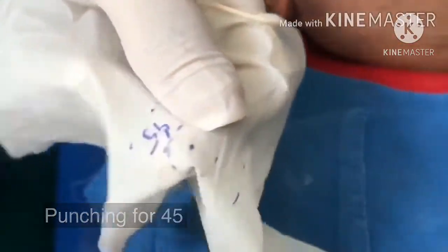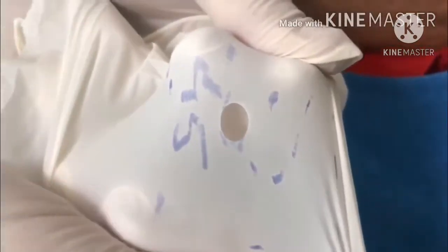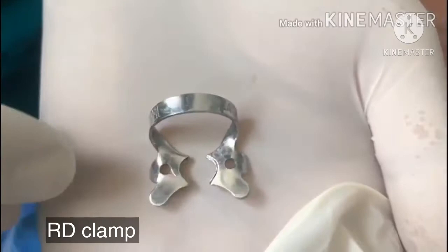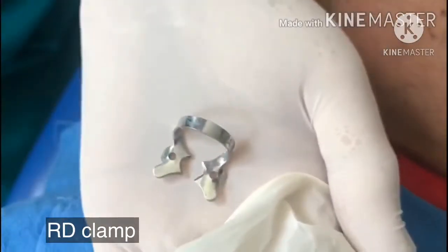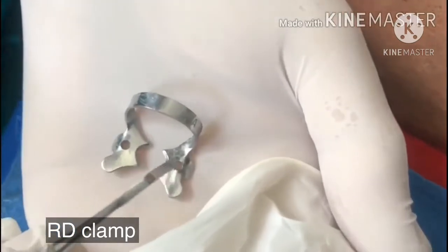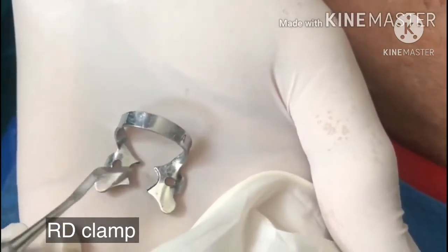We just pick it up and now you can see — this is the punch. Clamp 2A. This is the horizontal bar. These are the wings, and these go around the cingulum of the tooth.